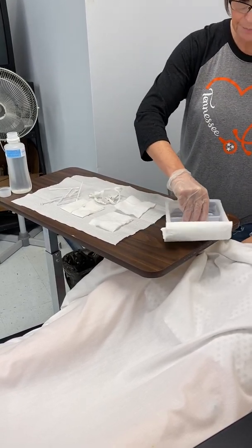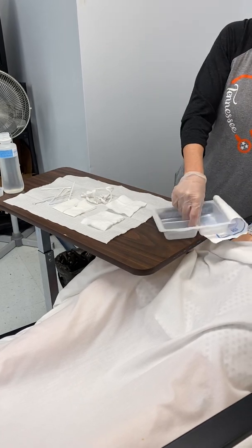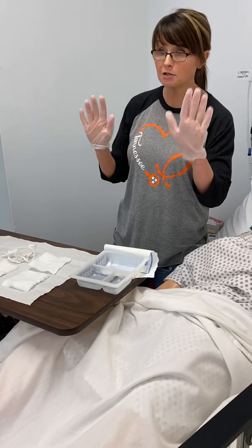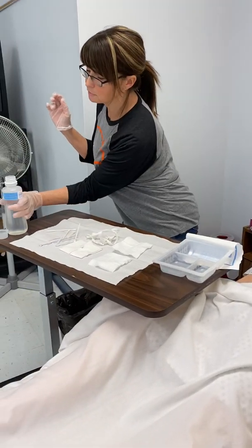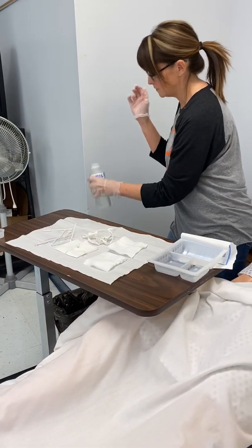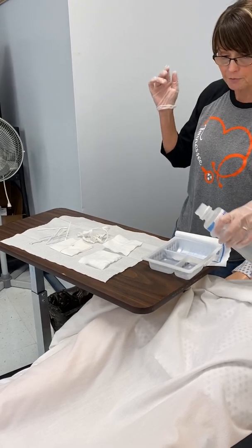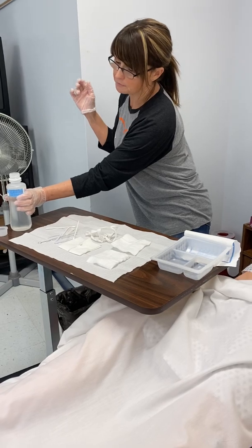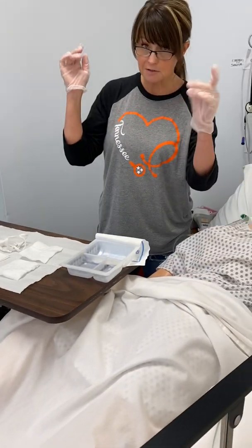I'm going to spin mine a little bit so that the bigger one is there. Now I'm going to contaminate my non-dominant hand. I'm going to come around my sterile field, whip it, and I'm going to pour my 3 basins full of the normal saline. Come back around. This hand is contaminated.